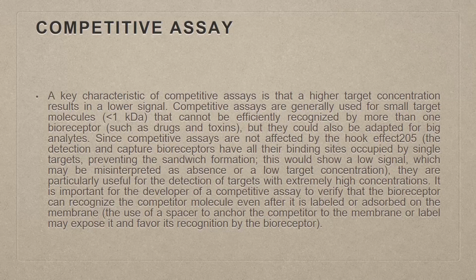So basically it is a competitive binding, something which binds to the target better versus something which binds to the target weaker. Based on these binding assays, we decide how much of the molecule of interest or pathogen is present on the substrate or the material you are sampling. Now, the key characteristic of competitive assays is that higher target concentration results in lower signal.